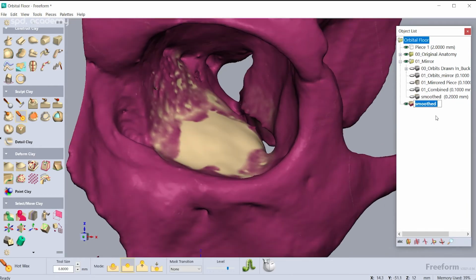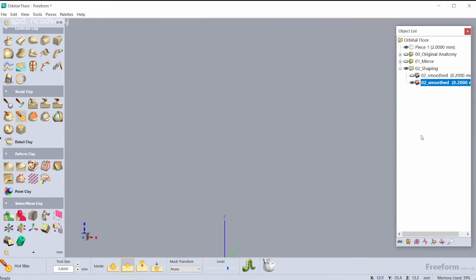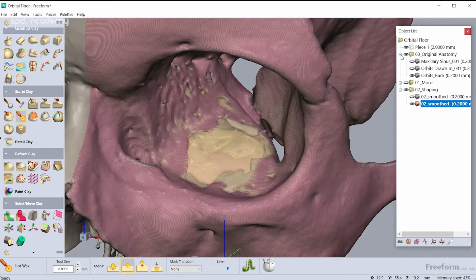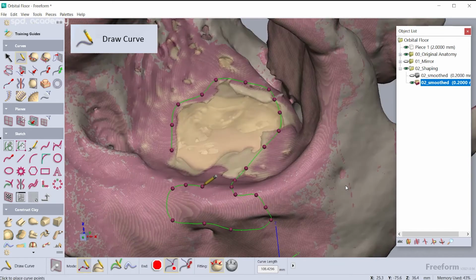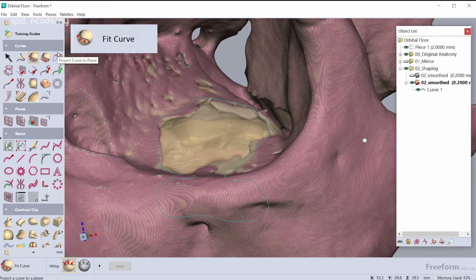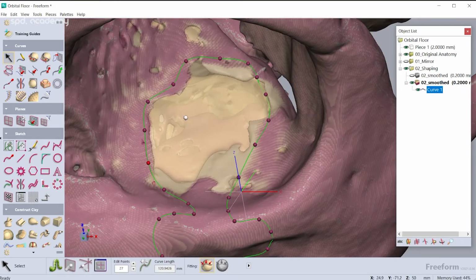Duplicate the piece. On the reconstructed piece, turn on the see-through function to help draw the plate extents. Turn the original defect anatomy to visible. Use smooth, rounded features with no sharp corners. This is for ease of manufacture and user safety. Use the Fit to Clay on Create option. Manipulate the edge contours to contact the residual orbital bone where possible. This will help stabilize the otherwise mostly floating implant.